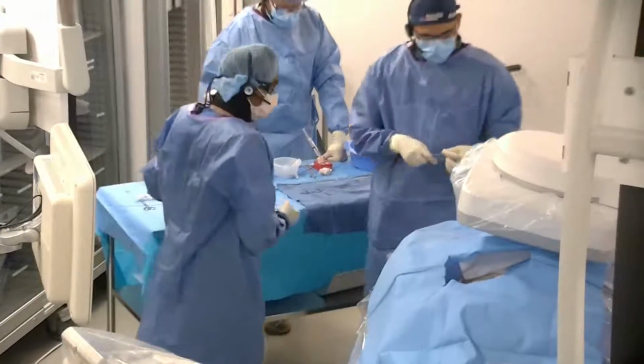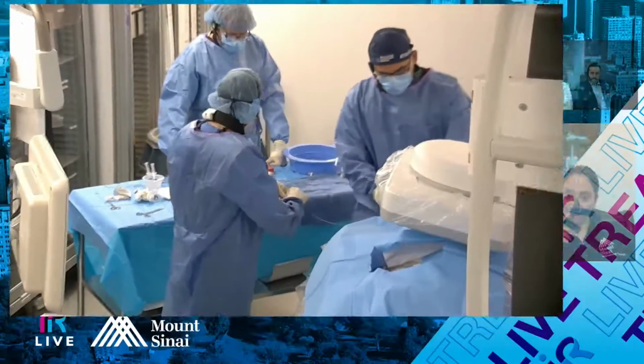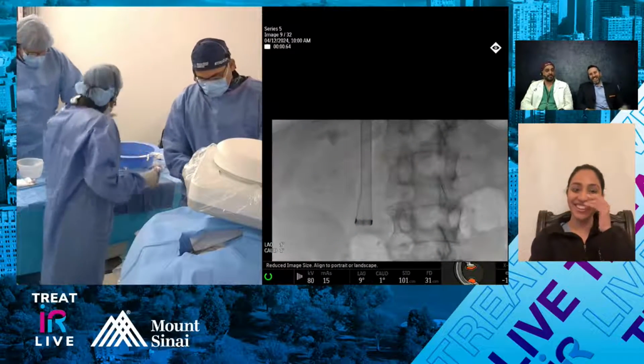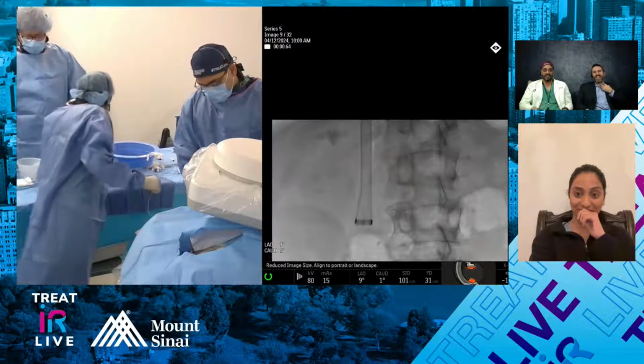The other thing is, again, Scott's our quality guy, so we'll talk a little bit about this. One thing I always say when we do these complex filter retrievals, and I tell the fellows this too, is that wellness matters too.